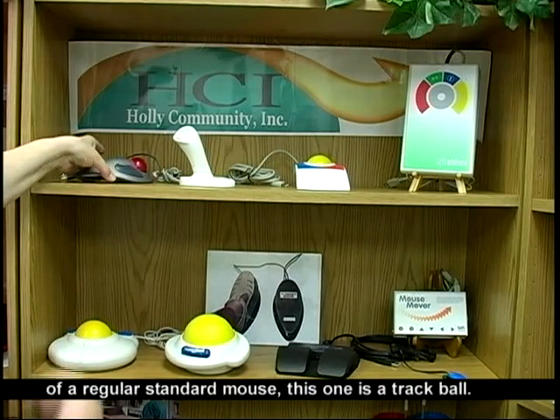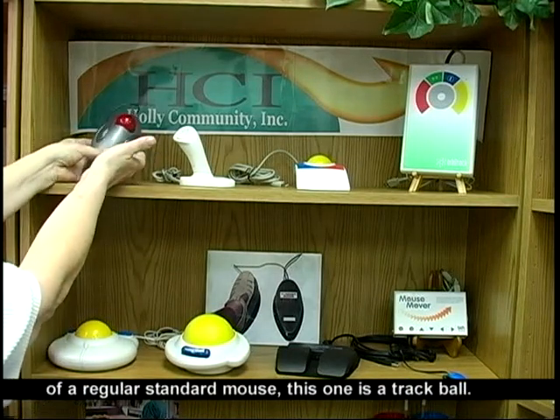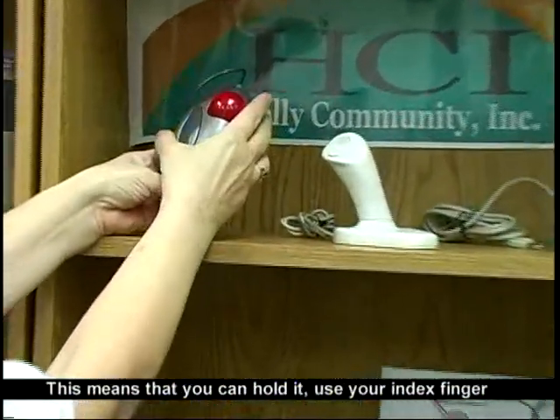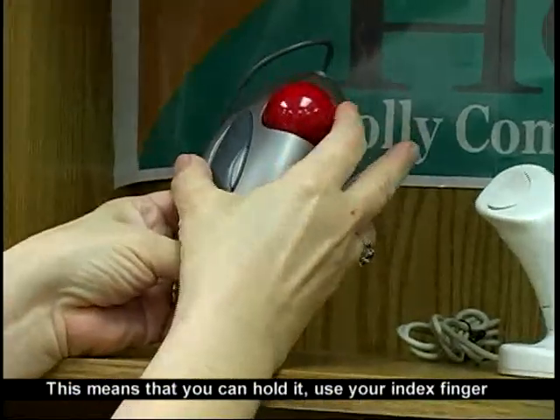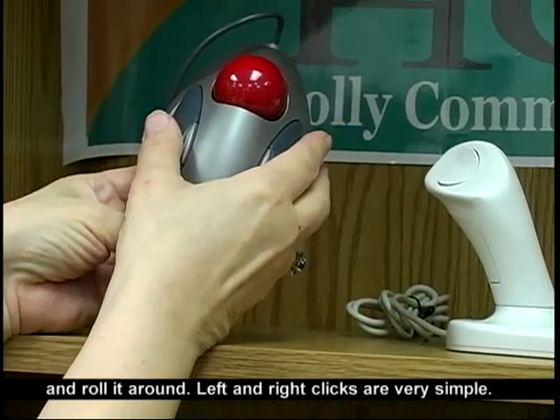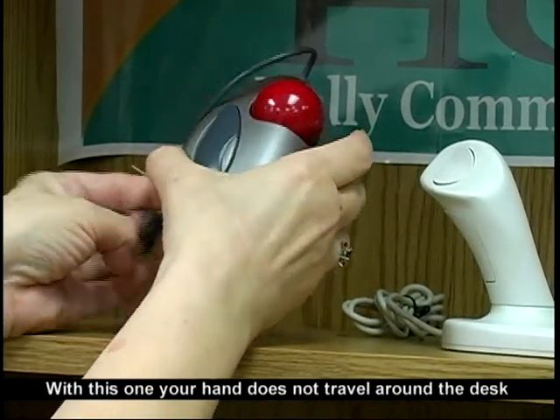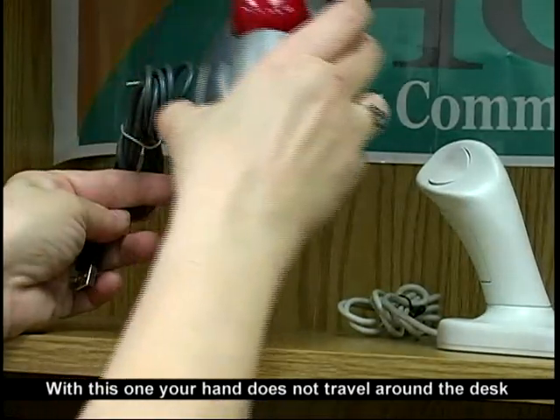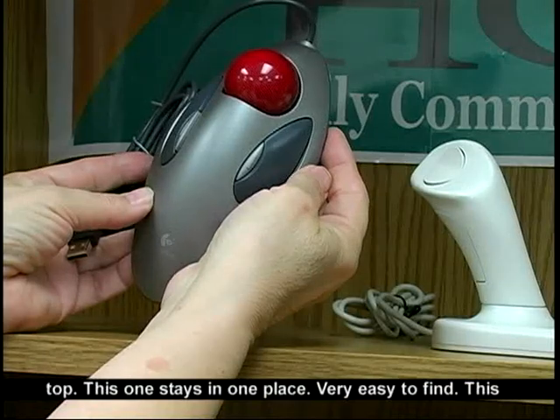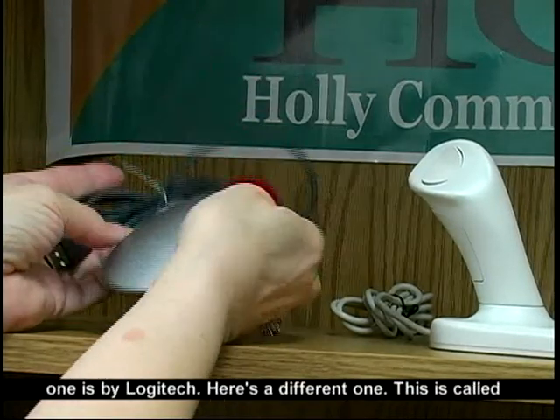Now instead of a regular standard mouse, this one is a trackball. This means that you can hold it, use your index finger, and roll it around left and right. Clicks are very simple, but your hand does not travel around the desktop — this one stays in one place. Very easy to find. This one's by Logitech.